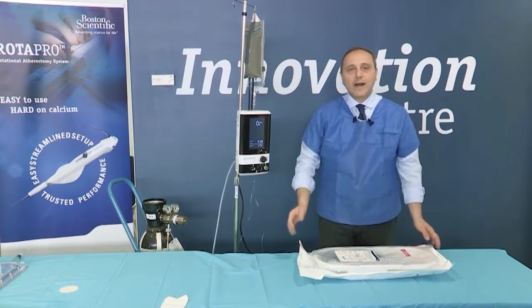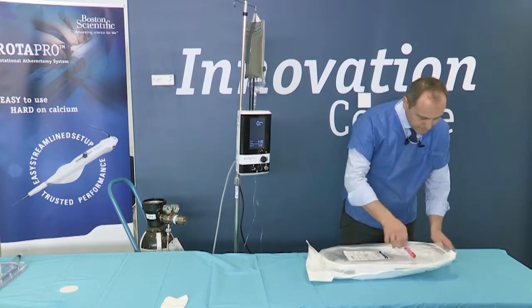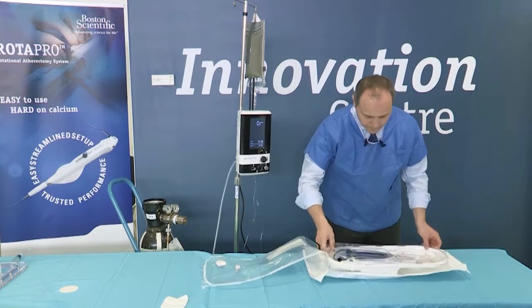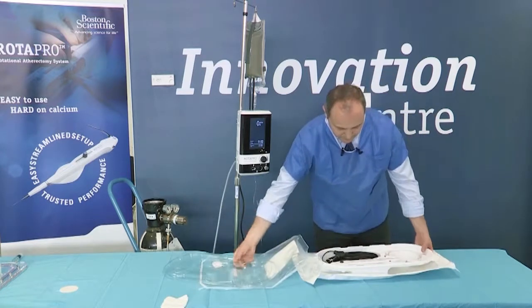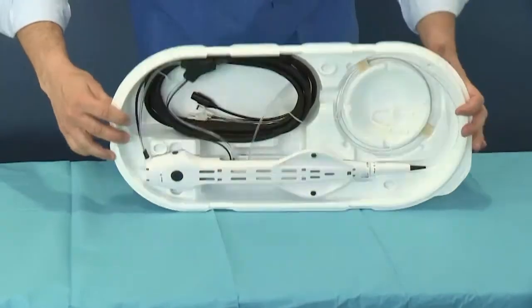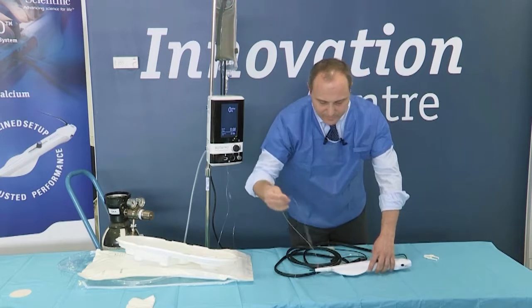We are now ready to unpack the ROTAPRO. Let's do that together. There we go. This is our system, ready to be connected.